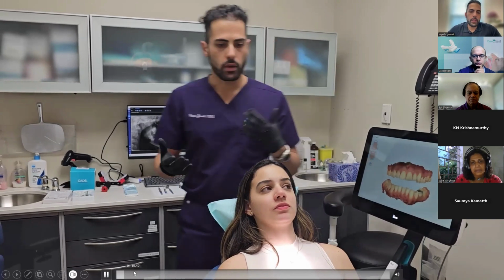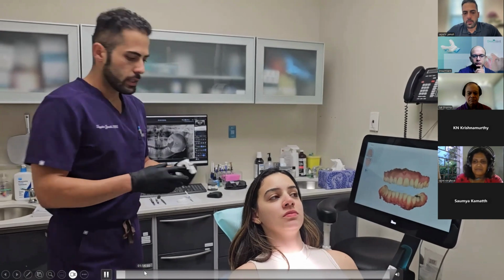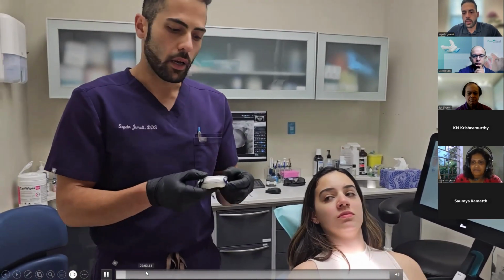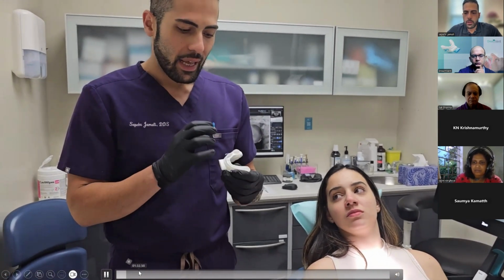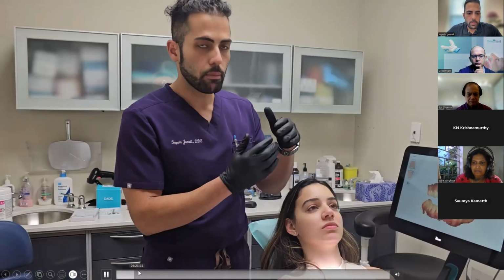And after that, we just start the extraoral examination that we always do for all the patients, starting with the palpation of the TMJ.